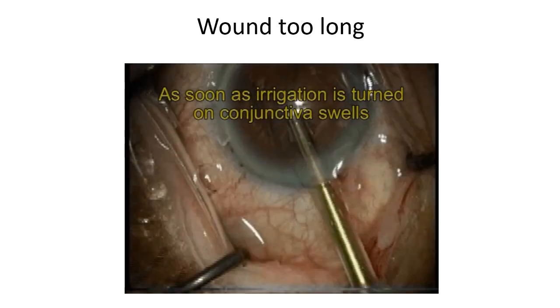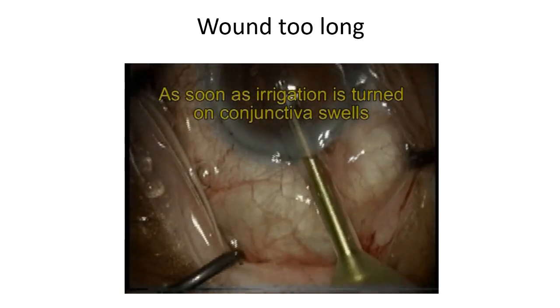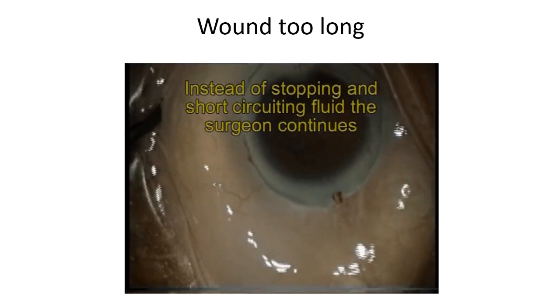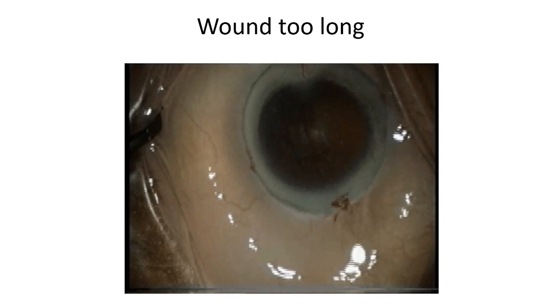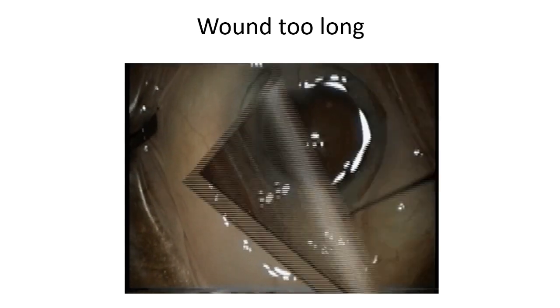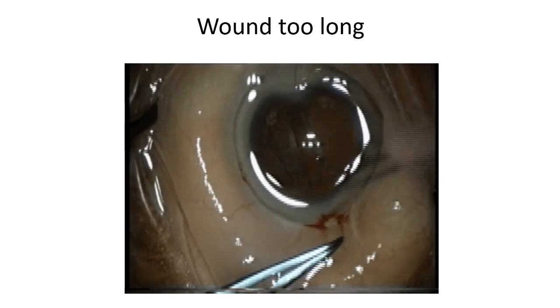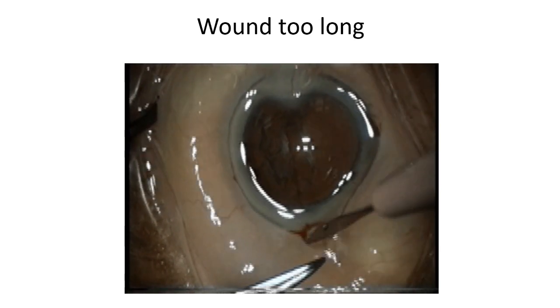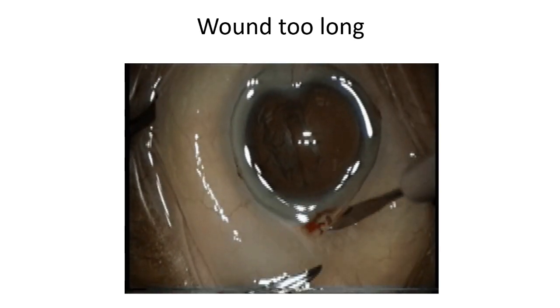As soon as the phaco probe goes in, the conjunctiva starts to balloon. Now what you should do at this stage is come out and immediately make a small peritomy. But she doesn't do that. I was actually out talking to the theatre sister at the time, and this makes surgery much more difficult. Now she's got to deal with a situation where it's almost like operating at the bottom of a swimming pool.